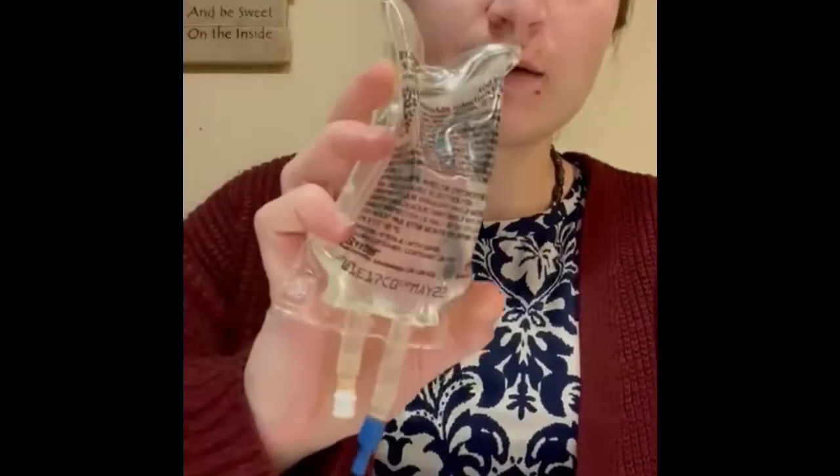So first of all, I'm going to look at my IV guidelines. I have them here, a card. So our client, we don't want to give him extra fluid than he already has. So according to the continuous infusion, I would go with the furosemide 3.2432 milligrams per ml, which is 48 mLs of furosemide and 100 mLs of diluent, which is in this bag.